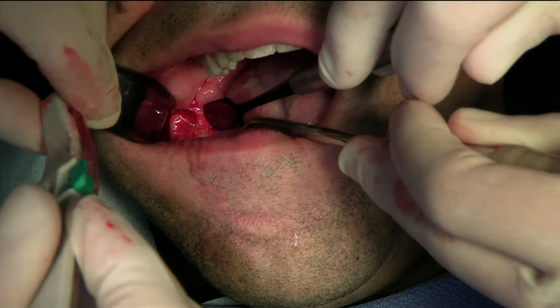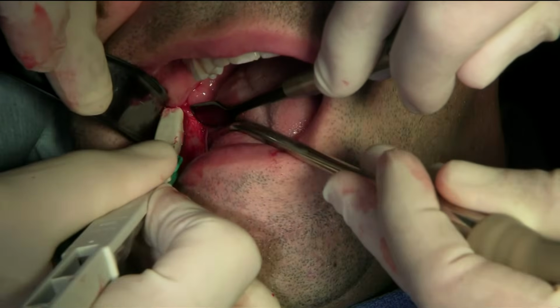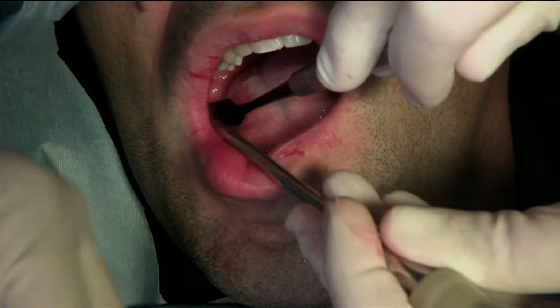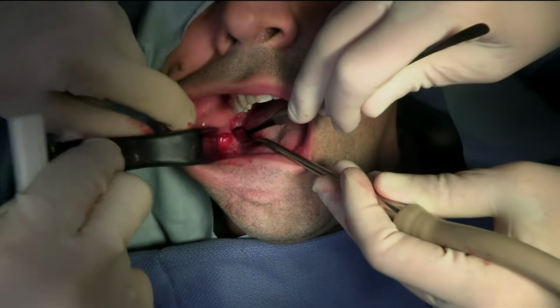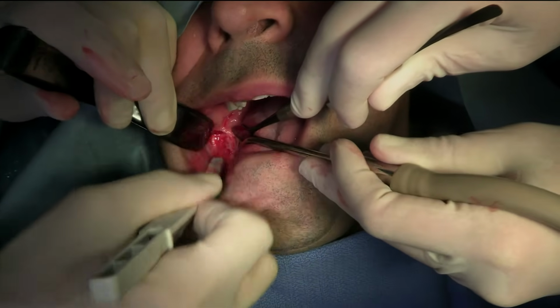Pressure. Taking it here from the external ridge.